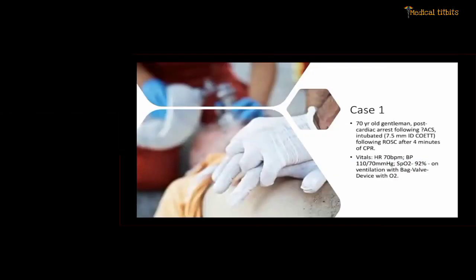First case I have selected is a 70-year-old gentleman. He had cardiac arrest following maybe acute coronary syndrome. He attained return of spontaneous circulation after 4 minutes of CPR. Now he is intubated with the 7.5 millimeters internal diameter cuffed endotracheal tube.